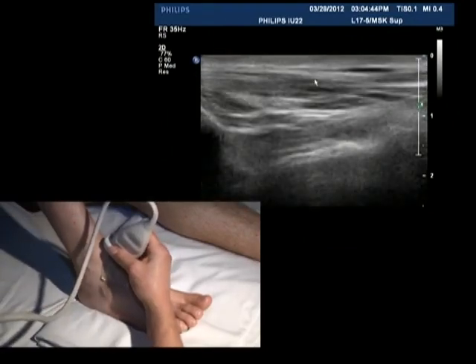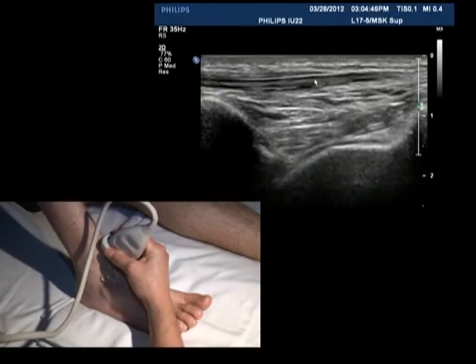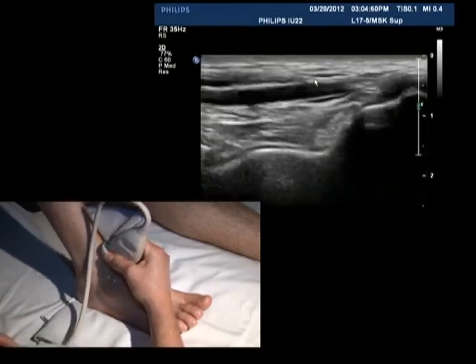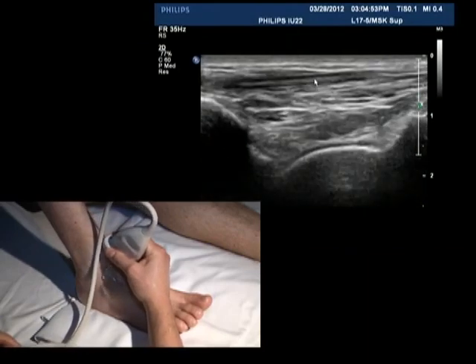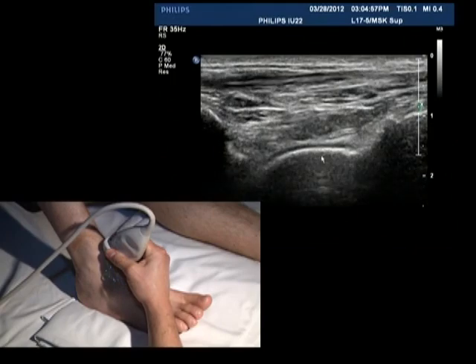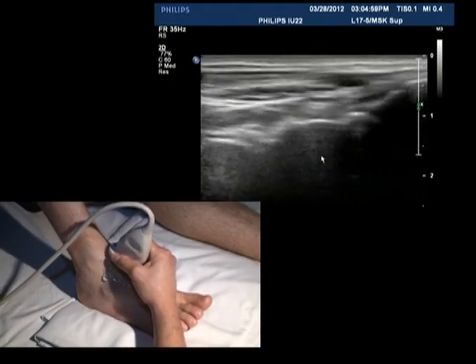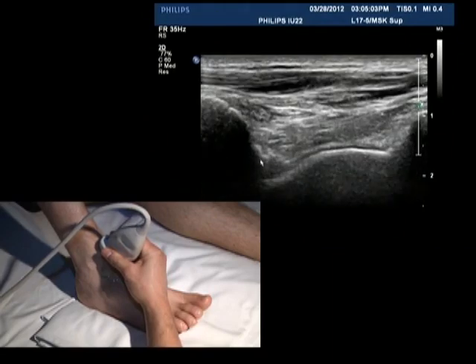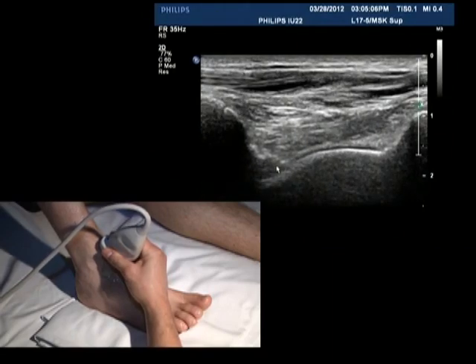Again, you can look at the ankle joint. You can see he's got a nice ankle joint. Again, here's the tibia up here. Coursing down, there is the talus. Again, there is that hypoechoic area, which is the cartilage overlying as well. You can see the head, the neck, and then the head as well. So you can see the tibiotalar joint. Here's the anterior recess. You can slide a needle right in if you need to.